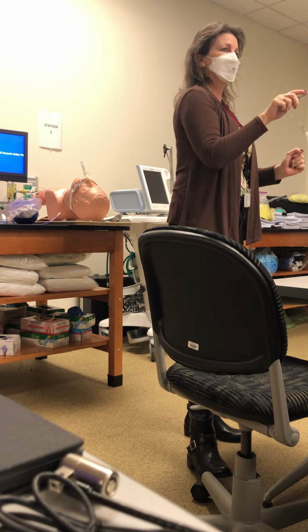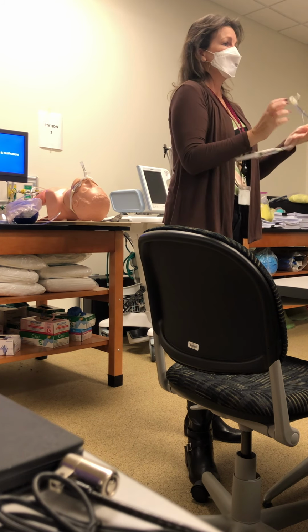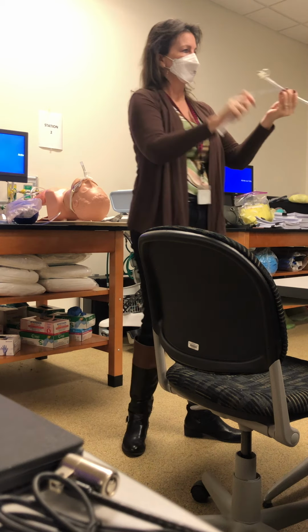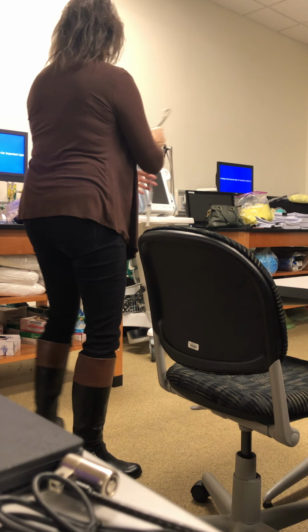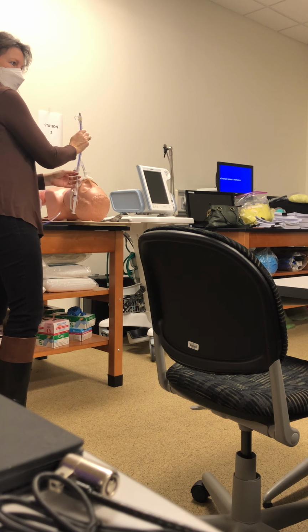You're the therapist. If you're assisting, make sure it goes back in the sleeve. Okay, you're the one handing him the tube if you're not intubating, if you're assisting. All right, so you want to hand him the tube with everything ready. So if you're standing to the left of him, you're going to hand him the tube like this. If he's standing here and you're here, you're going to hand the tube like this, all right?